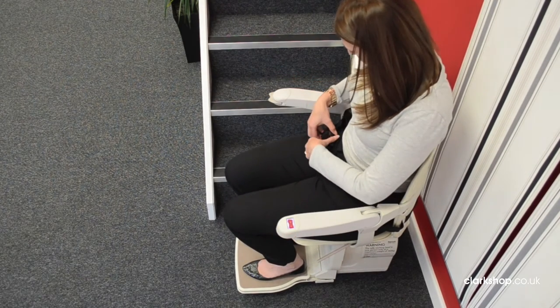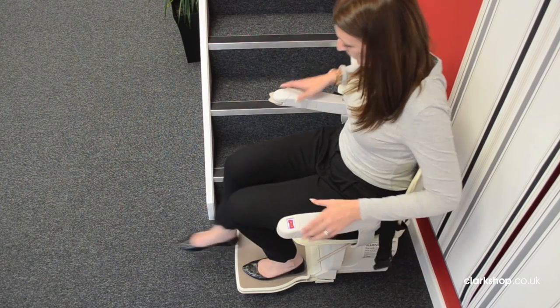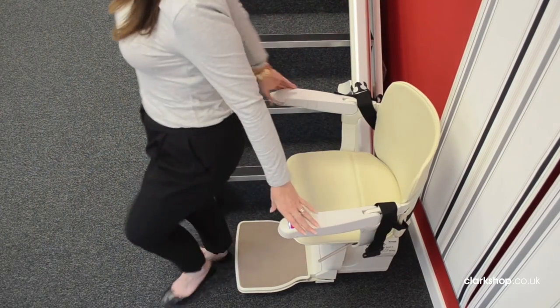Once you reach the end of the stairs simply undo your safety belt, exit and fold up the seat, arms and footplate.